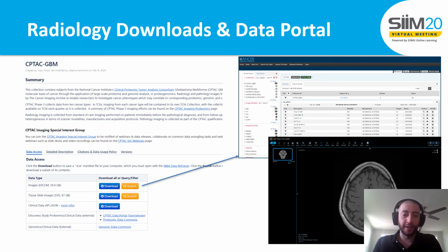This is just a quick look at the radiology downloads and data portal section of the site. So for every data set, you'll be taken to a homepage and you can click on search and use the more granular filtering capabilities that you see in the top screenshot. We also recently deployed the OHIF viewer, which allows for in-browser visualization of the images.